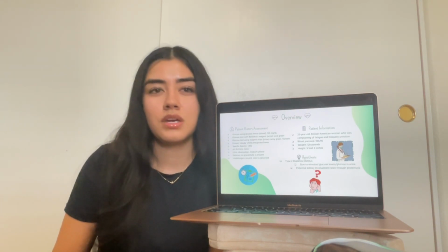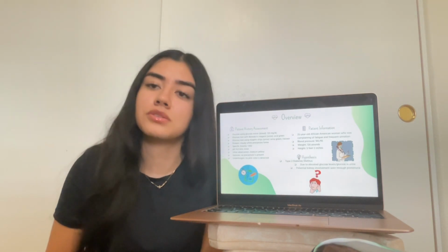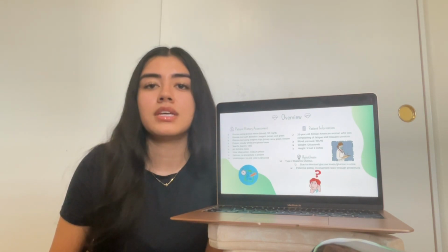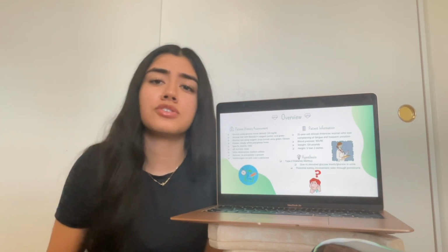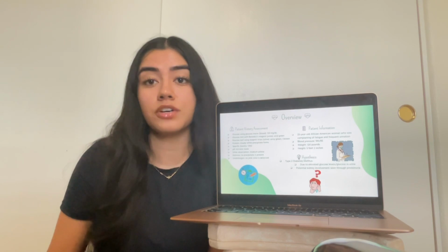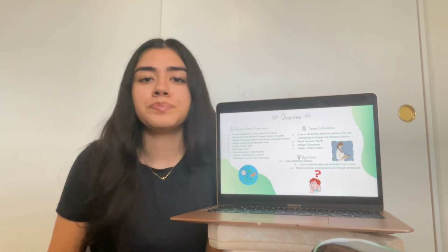my suspicion. Additionally, the specific gravity of 1.002 is slightly below the normal range of 1.005 through 1.030, which raises a concern about kidney function. This could signal impaired renal concentration ability or even things like chronic kidney disease. The appearance of a cloudy white precipitate during protein testing points to proteinuria, a potential sign of kidney dysfunction or damage. This is significant since a healthy kidney typically filters out protein molecules.